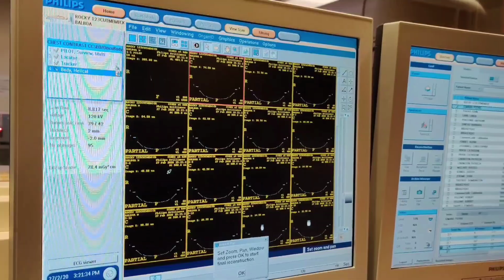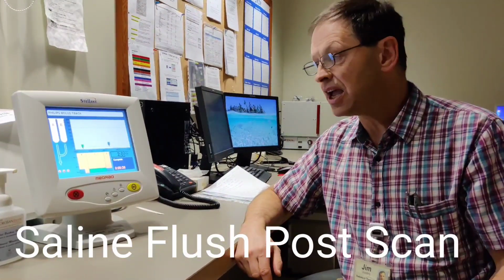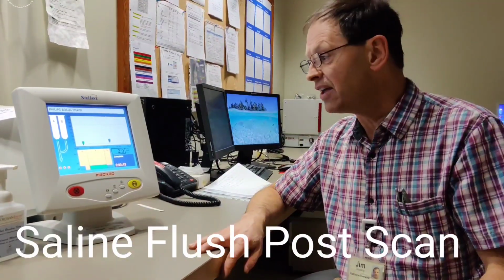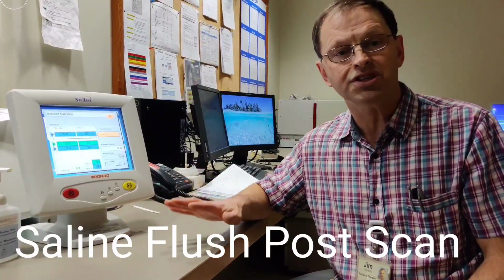At this point, we're done the scan. We can process of injecting a 20 ml flush to, again, remove any contrast from the IV line and to flush the IV itself so that the patient now can be disconnected. You can proceed with your tattooing and all your referencing, and you can return the patient to RadPro.